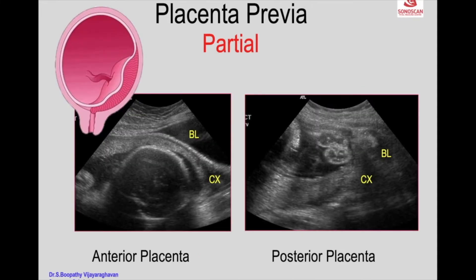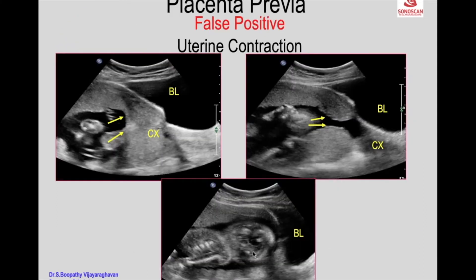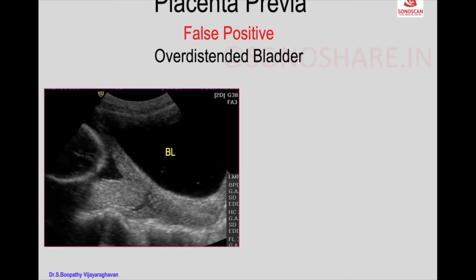Here this is the anterior placenta. You see the anterior placenta comes up to the edge of the internal os. When the internal os dilates, it will partially cover the internal os. However, the cervix is actually very far away from the placental margin. So this is a common case of false positive diagnosis of placenta previa.